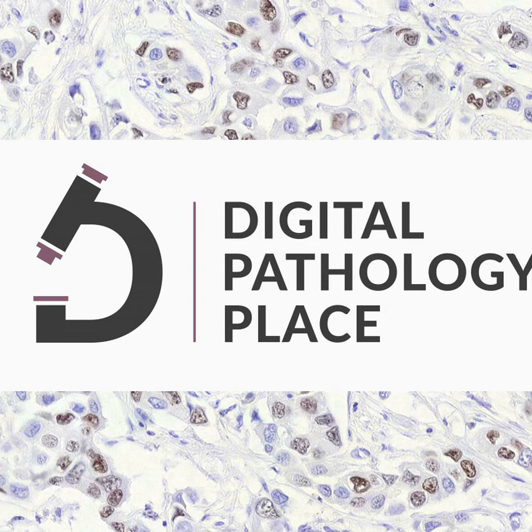Any benefits for the patients? How would you describe why AI is more beneficial for the patients? Good question. I think ultimately it comes down to the accuracy of the test, whatever test it is, but certainly in image analysis, the accuracy of that test. You need to make sure that it's detecting only tumor cells or as much tumor as it can. The quantitation of the biomarker itself, whether it's nuclear or cytoplasmic or membrane, making sure that's as accurate as possible, so that when it gets to that stage where you're defining a cutoff to enroll or not enroll a patient, that's as accurate as possible.